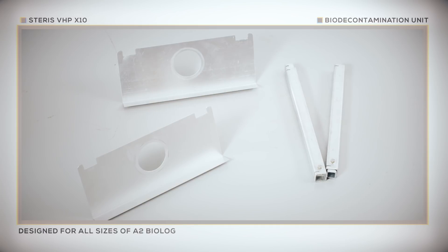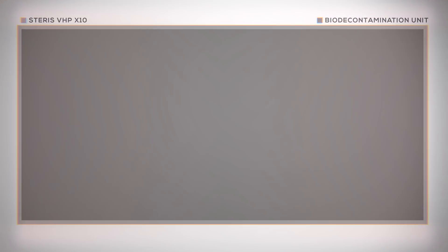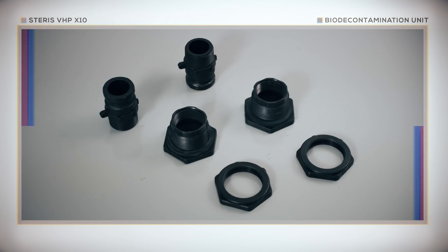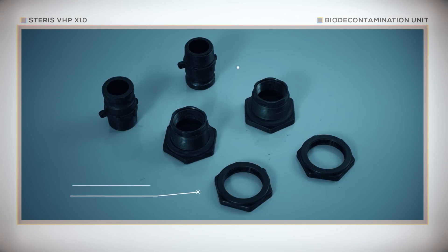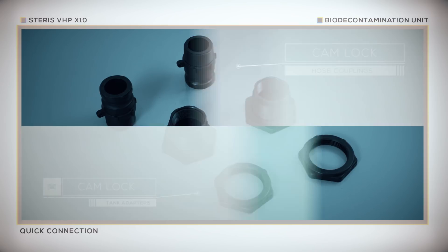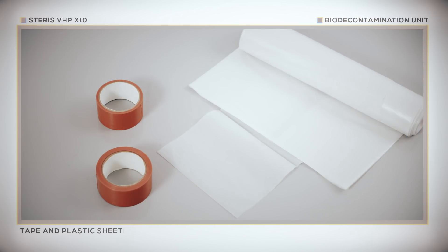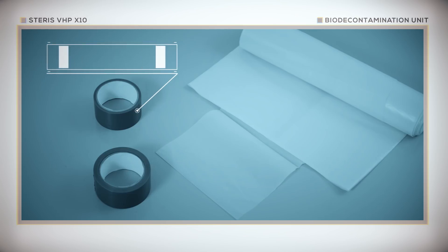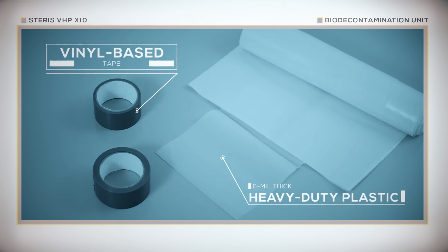Designed for use on all sizes of A2 biological safety cabinets, the sash adapter and return frame can be adjusted for easy installation. Additionally, there are two CamLock tank adapters and two CamLock hose couplings which allow for a quick connection between the X10 unit and cabinet. Tape and plastic sheeting are also required to seal the biosafety cabinet before bio-decontamination. These items are not provided by Steris but are readily available from hardware or home improvement retailers. Steris recommends a vinyl-based tape that leaves minimal residue behind on surfaces, and 6-mil thick heavy-duty plastic sheeting.